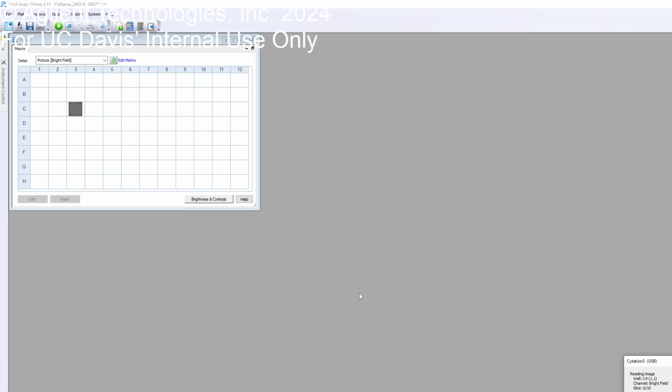In the meantime, do you guys have any questions? And you were talking about the vibration table? The vibration table. It does seem like yours is a little bit on the older side. If you see here, there's an indicator. When you get it, it's absolutely green, and then when it sinks, it starts turning red. When it's completely red, at that time you have to replace it. So yours is still not completely red.